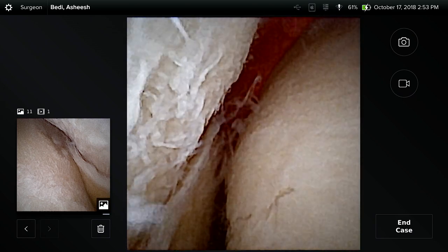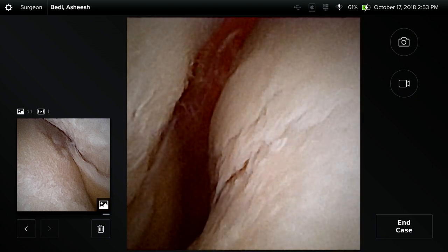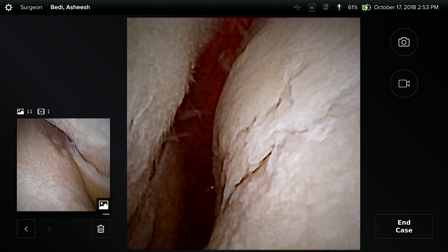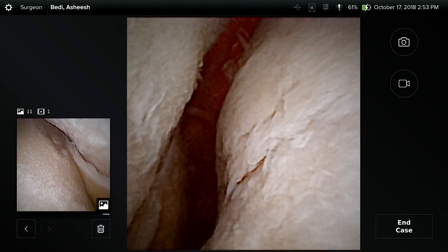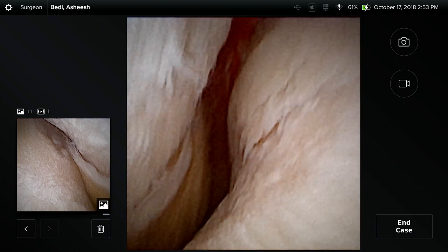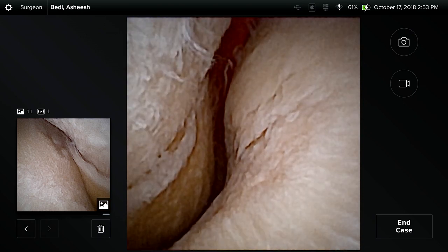You can see a unique view of our patellar cartilage and trochlear groove — there you can see fissuring in the deepest aspect of the trochlear groove, an exceptional view. This may be something we would want to do prior to a tibial tubercle osteotomy or MPFL to assess chondral surfaces and confirm the patient is a suitable candidate. All things we currently rely on MRI for, but here with a nanoscope with essentially no additional morbidity, we can assess that in the OR.